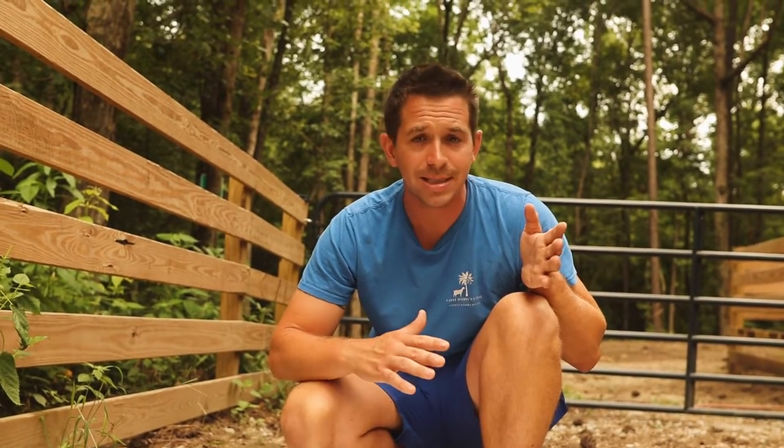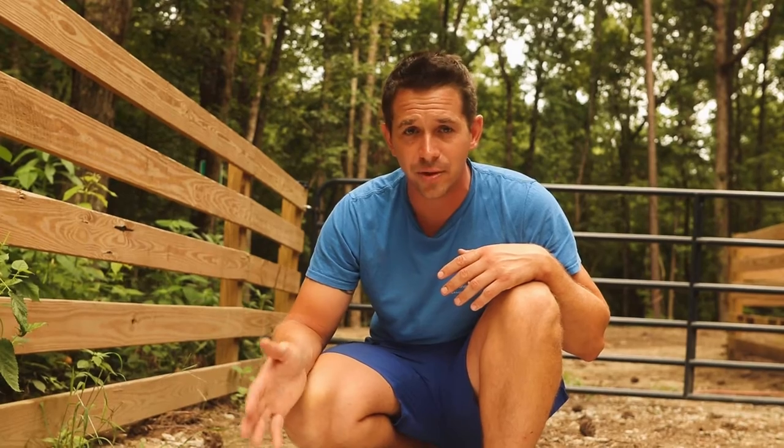So with these guys, what we're going to do today is insert the CIDR and give everybody a shot of two cc's of Lutalyce. 14 days from now, we'll remove the CIDRs and give them another shot of Lutalyce and put them in with the buck. They should be pregnant within about two days from that. And then 145 days after that, they're all going to have babies — so we have all these cute little babies to post videos of, and also we have all of our milk production for the wintertime.